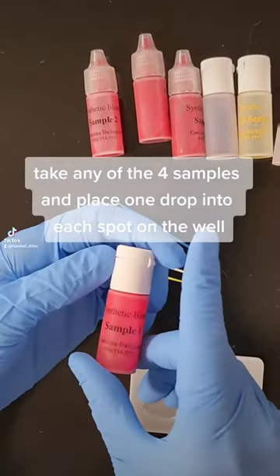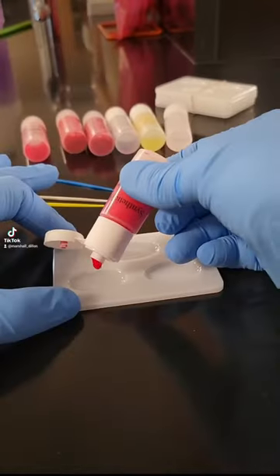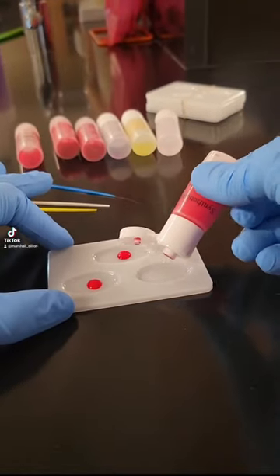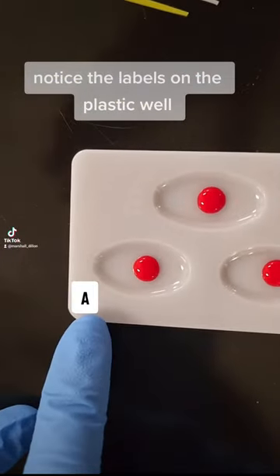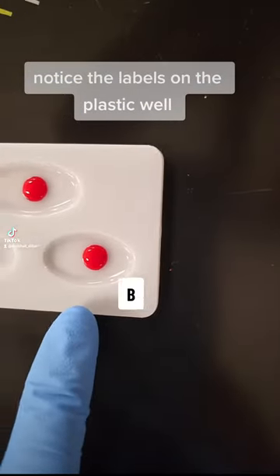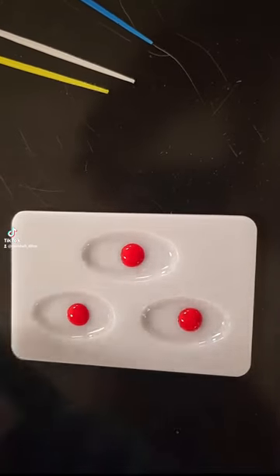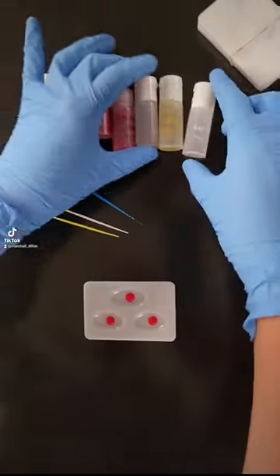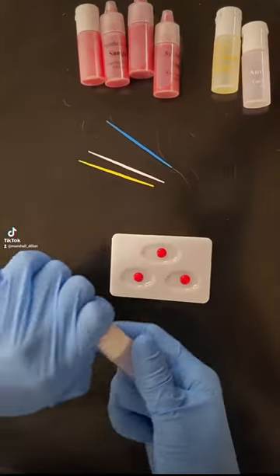Take any of the four samples and place one drop into each spot on the well. Notice the labels on the plastic well. Place the corresponding anti-serums into the spots on the well.